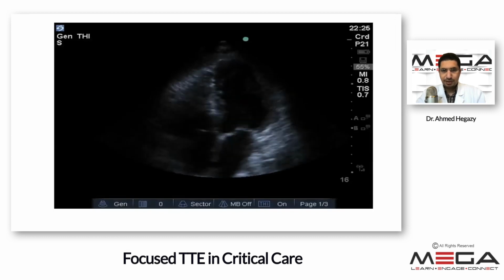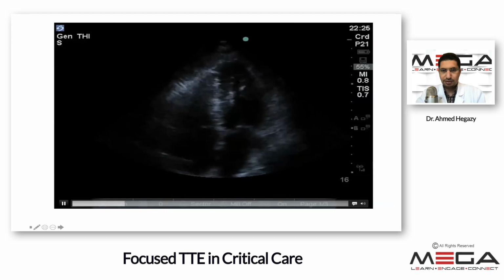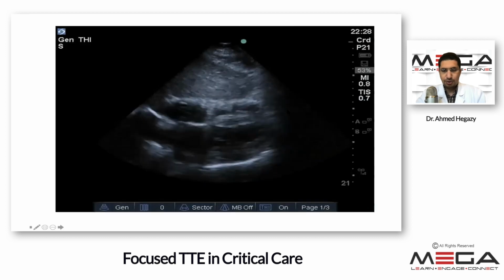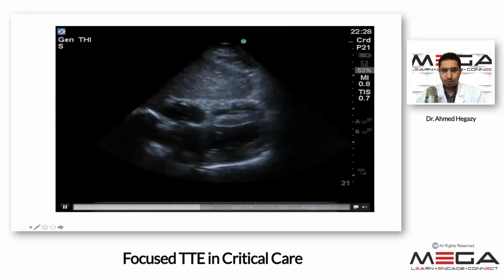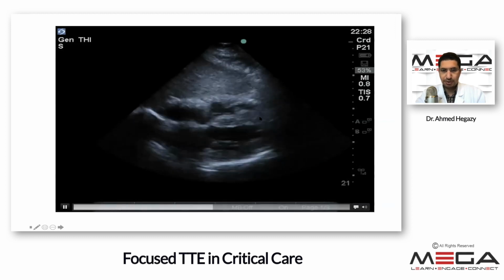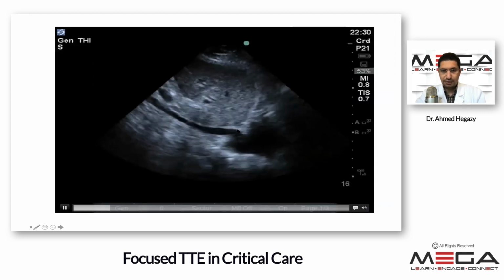Again, we see an apical 4-chamber view here, and that confirms what we saw in terms of end systolic effacement, with the LV looking like the walls are touching with each systole. And with the subcostal four-chamber view, we see here that it's confirmed. I mean, the LV contractility looks fine. There's no wall motion abnormalities. The RV size looks fine. There's no pericardial effusions. And so we move on to the IVC.